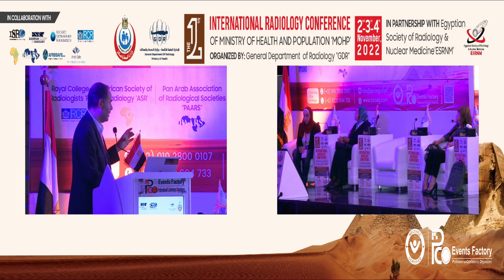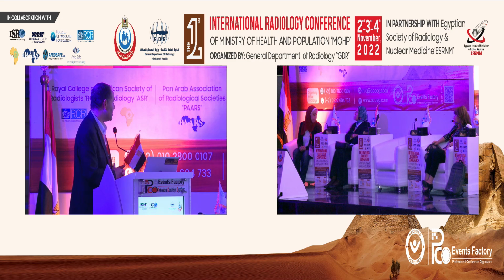In MRI, you can see 3 or 4 millimeters. So the spatial resolution in CT is better. And if you ask most of the radiologists here in the room, most of them are familiar with CT. But in young patients, especially, Crohn's disease is common in young patients, so I will start with CT, but each follow-up I will do it with MRI. You have a baseline, then MRI after that.